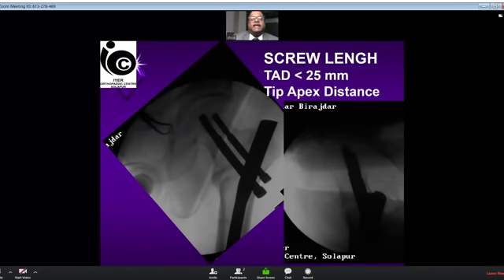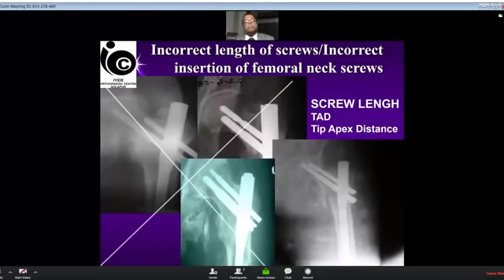So friends, in an intramedullary implant, I request you to measure the TAD not from the fovea centralis, but from the subchondral bone, from the articular surface. The TAD should be less than 25 millimeters, both in AP and lateral, or you can go even more subchondral to get the best fixation. I have been showing all on the left side. Superior screw longer, inferior screw shorter is wrong.